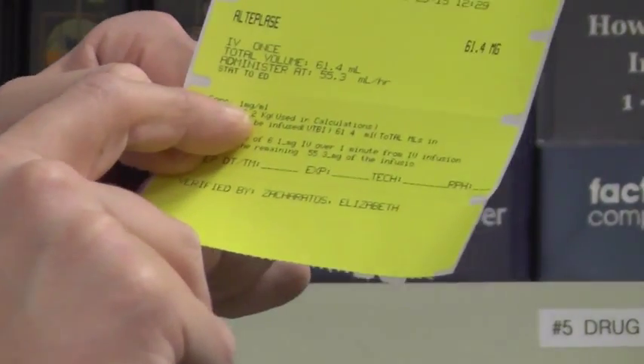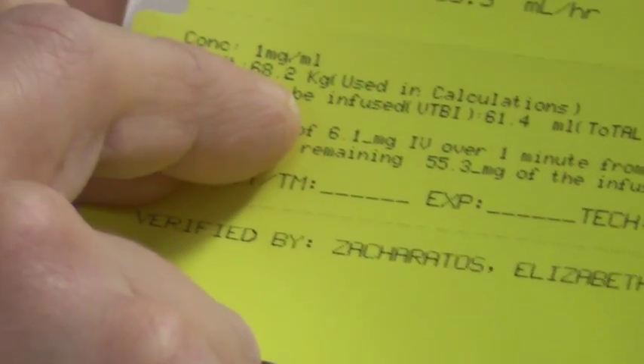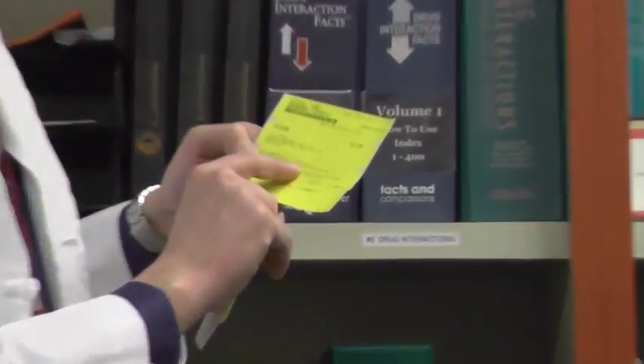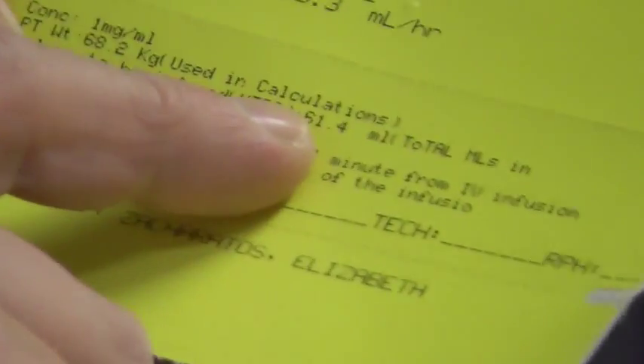The label will show the concentration, which is always one milligram per ml, and the patient's weight used for the calculations — in this case 68.2 kilos — as well as the volume to be infused, which is the total amount of volume the pump has to infuse. Since we're doing 61.4 milligrams at a one milligram per ml concentration, the total volume will be 61.4 mls in our final bag.